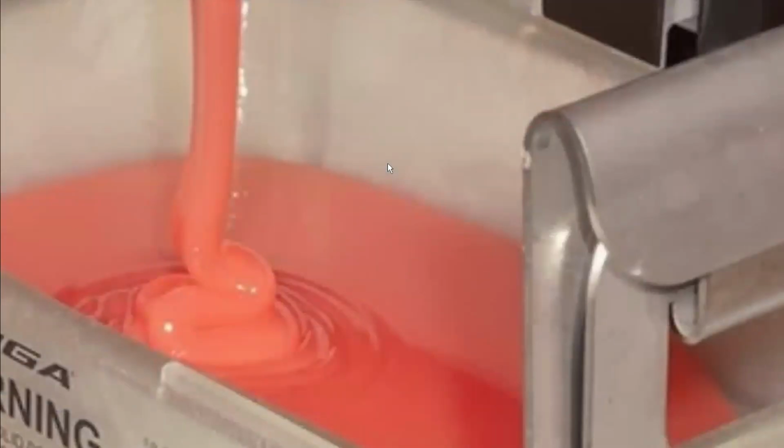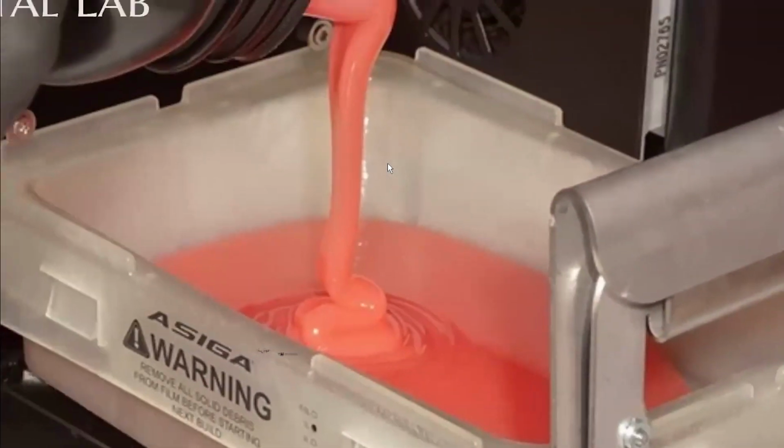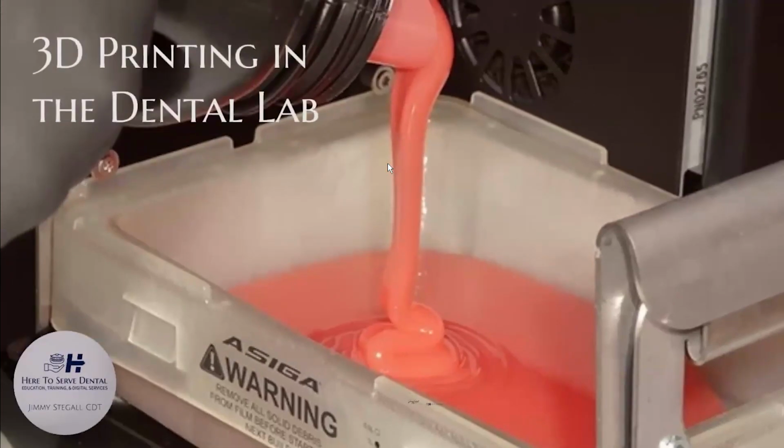Michael wants to know, he's having a couple of issues with their print separating from the build plate with proper supports. What could cause that? There are some settings in most printers, and the number one setting you want to look at in cases like that is what Asiga calls contact width. It's where the support from the platform touches your part. So your platform's up here, your support is here, and your part is here. That point where your support touches your part is called the contact width. We found with dentures especially, and denture tooth segments, that 0.3 millimeters is the normal default, but that's not enough. So we bumped that up to 0.4, even 0.5, and that reduced a number of failures.